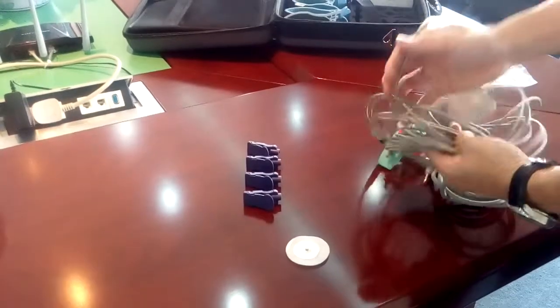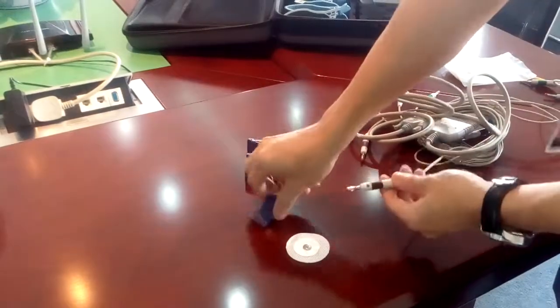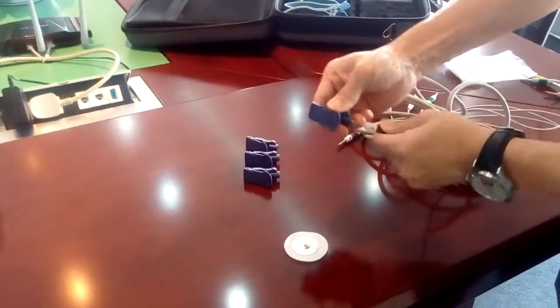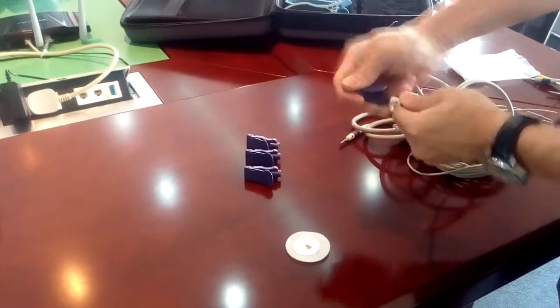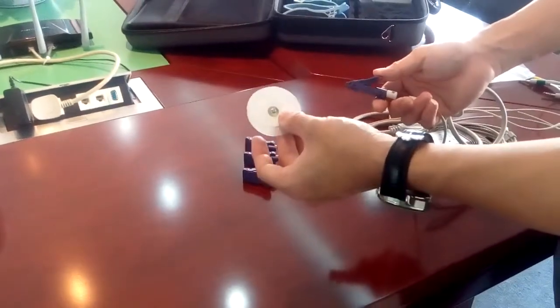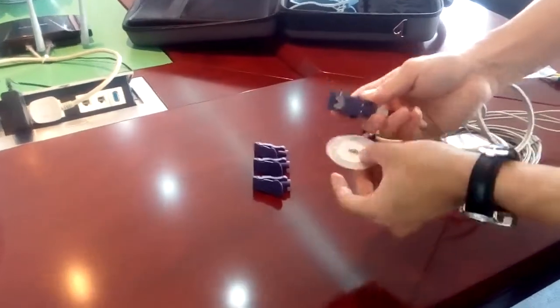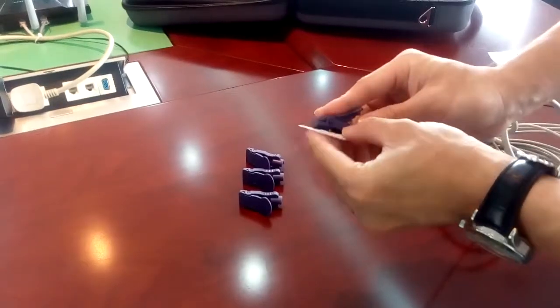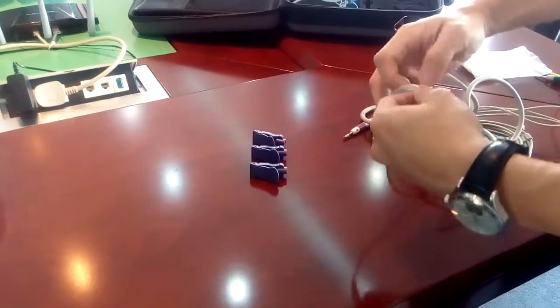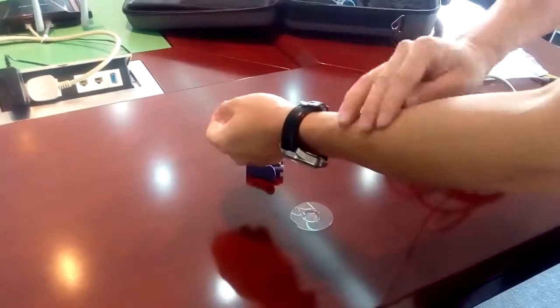For example, you take one lead out, connect with the adapter. If you choose this kind of disposable electrodes, you have to connect in this connector. Then you can put it on the patient's body.